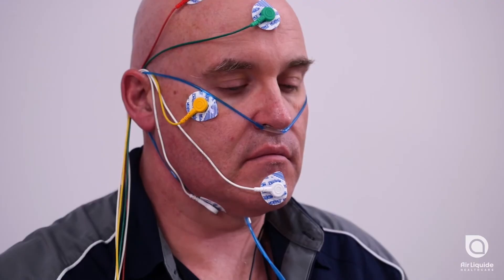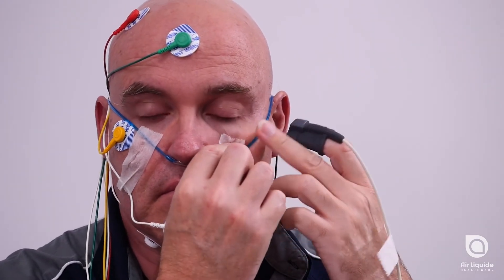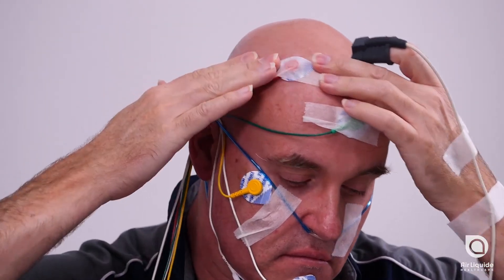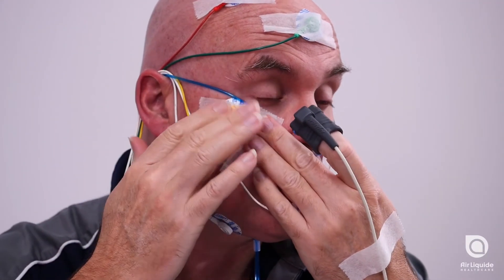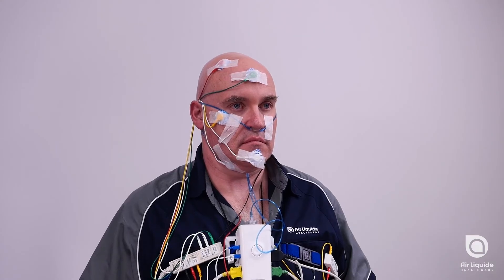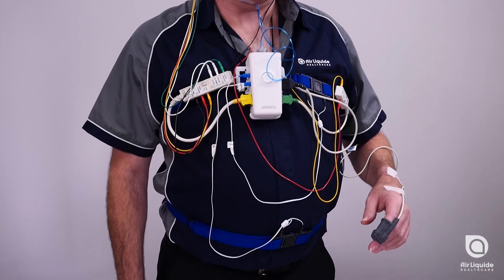Apply a piece of tape over each cheek to hold the cannula in place. The final action is to place tape over all the electrodes. You can now go to bed, and the device will start recording automatically at the time discussed with your sleep technician.